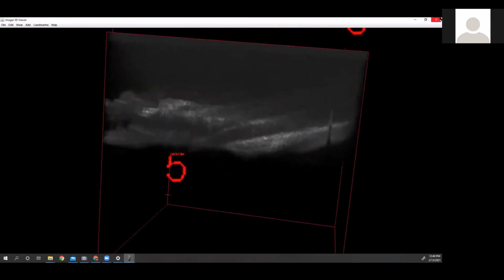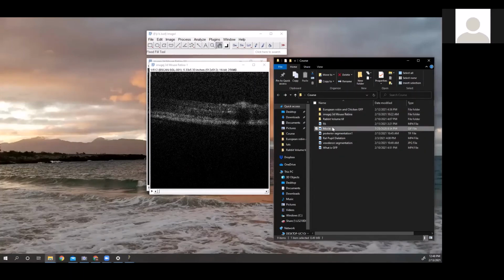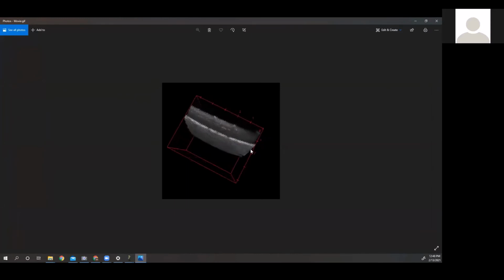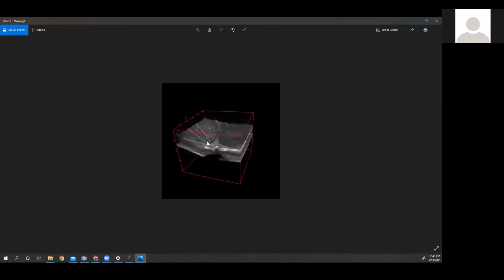So very simply, with just a little bit of time before the images can go in and just removing some of the noise, we can get a very clean image. This is the right one. And just by removing a little bit of the noise from the top and the bottom, this is the same set of images with, I mean, maybe 5 minutes of a little bit of extra work of doing just a little bit of denoising here. And we can see how much that clears up a 3D image. Now you guys might notice how there are lines coming straight down the sides of these.